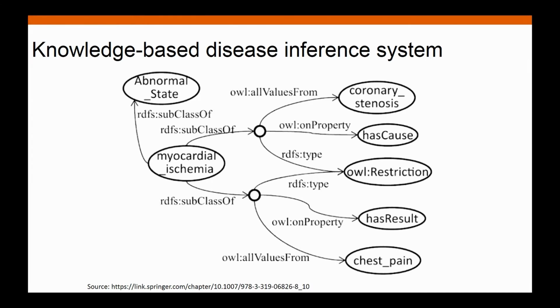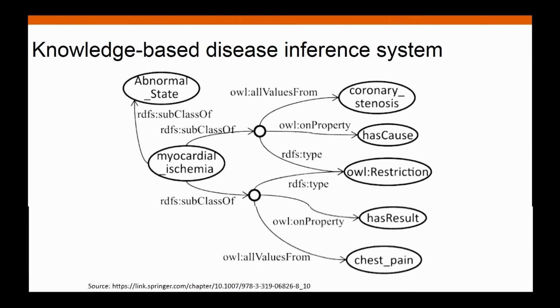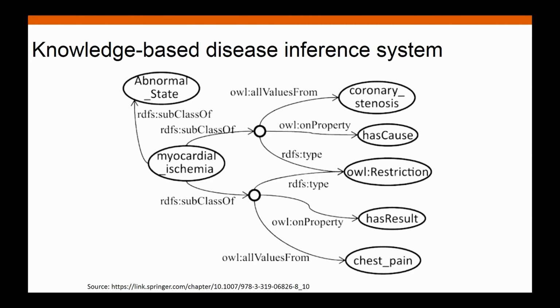thinking like there are lesions that the computer algorithm returned for a skin disease image. The lesions will have features A, B, and C. And maybe even the doctor will rely on the same rule, that some certain combination of the features could be used as a reference to have a certain disease X. So this is a relationship that we could use in our inference system. And after we have the disease information, we could also further infer the treatment plan or the medication plan.